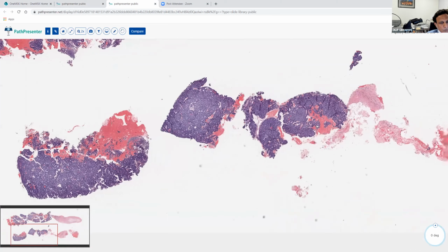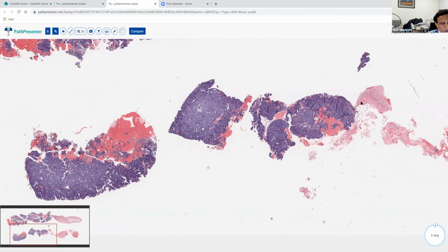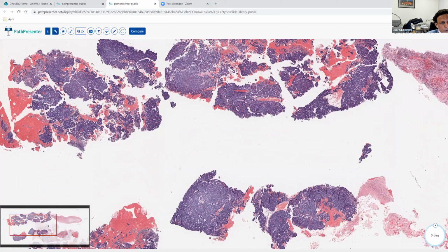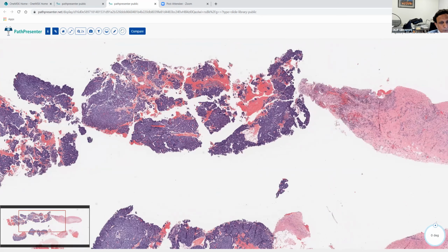Unlike our other lesions, which will remain intact in the same core, where you will see the process as continuous, papillary lesions, and certainly papillary carcinomas, tend to be fragmented. So that's something I always mention in the report, that there are fragments of papillary carcinoma.